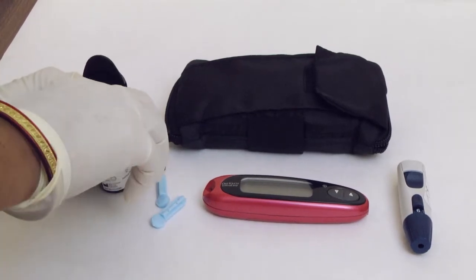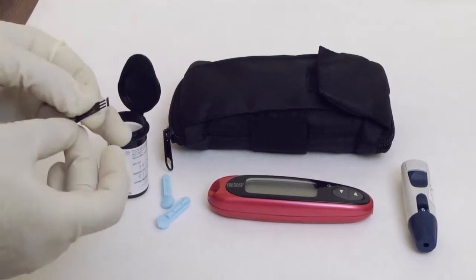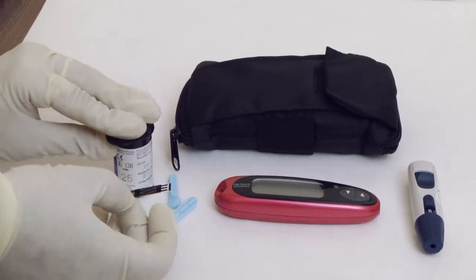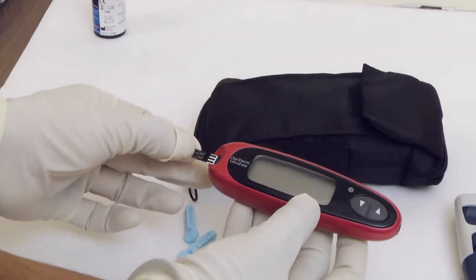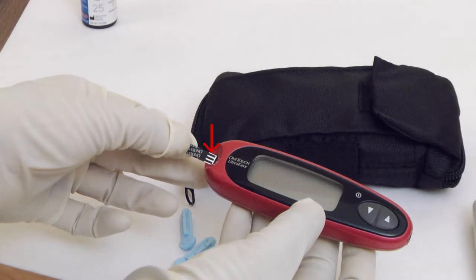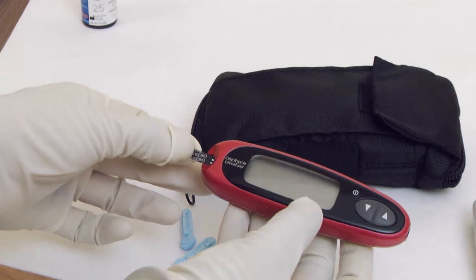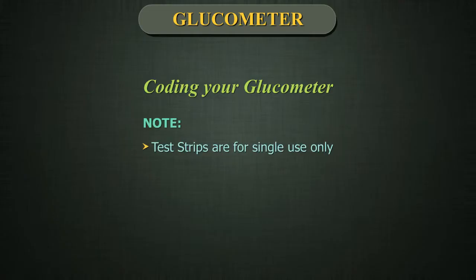Remove a test strip from its vial. Do not bend, cut, or modify the test strip in any way. Use each test strip immediately after removing it from the vial. Hold the meter as shown and insert the test strip into the test port. Make sure the three contact bars are facing you. Push the test strip in as far as it will go. Do not bend the test strip.